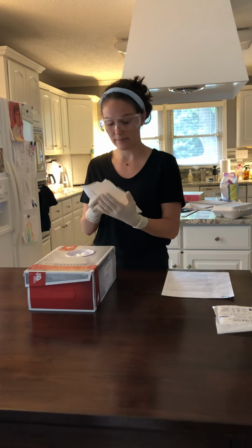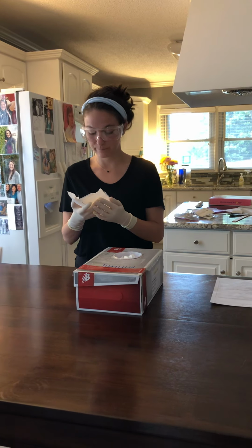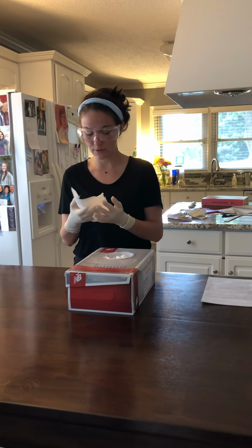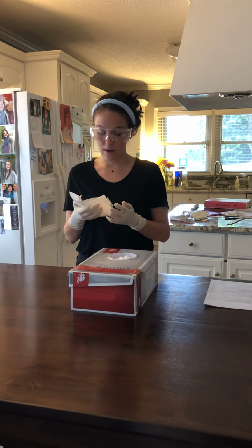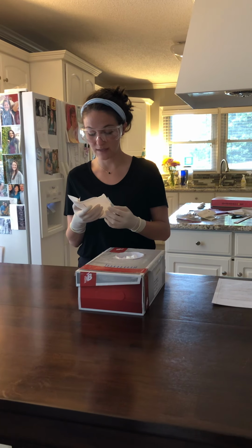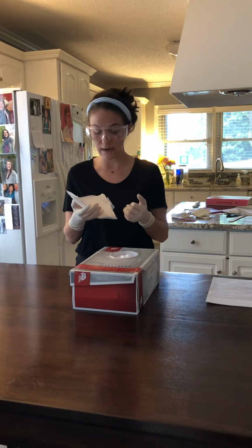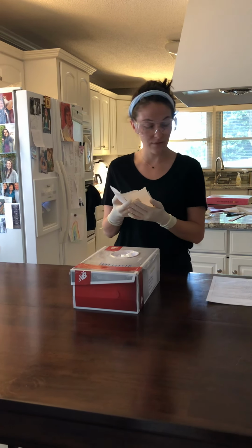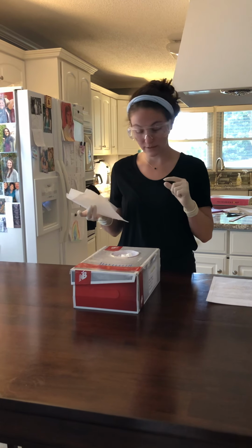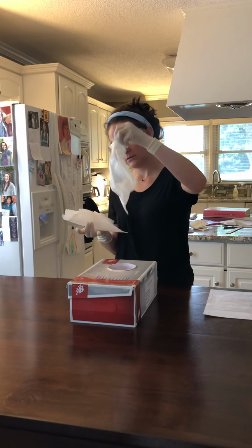All right, and Mr. Jones, okay, the type of secretions that we have on here are just regular purulent, and the amount is just a slight amount, and the concentration is very thin, and the color is yellowy, white, clear, and the odor is none, so we're all good. And now I'm going to take out your inner dressings.